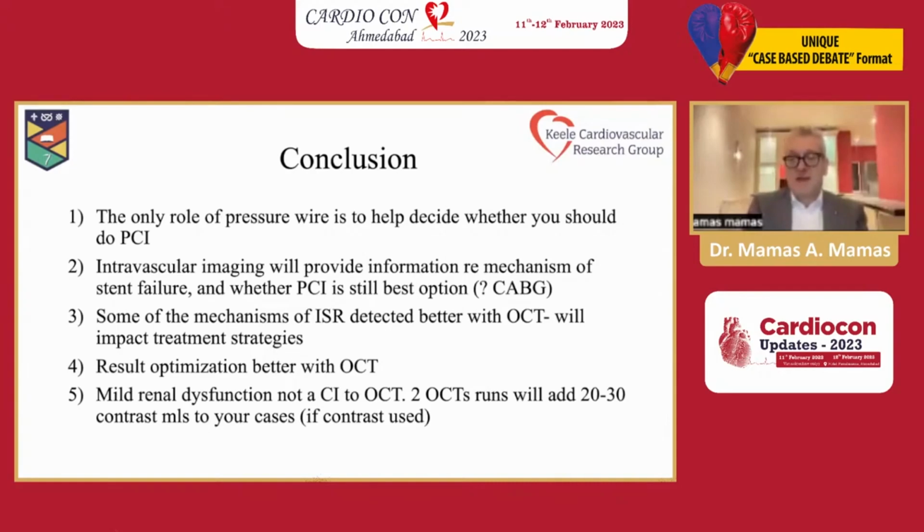So in summary, I think that I would use a pressure wire for this case to assess whether I would do the case, and then OCT for the rest of the case. I rest my case and hand back to the chairman, and thank you for inviting me to contribute.